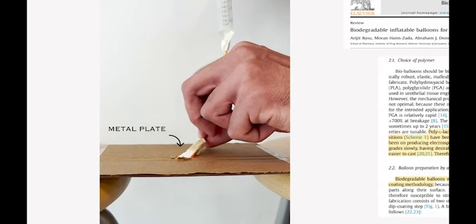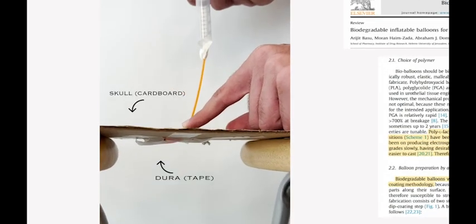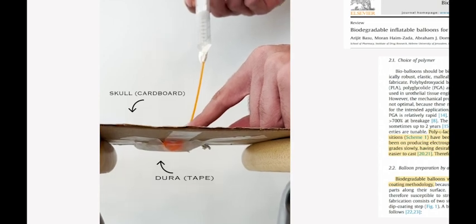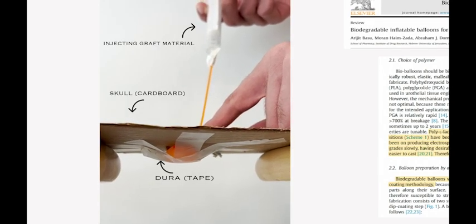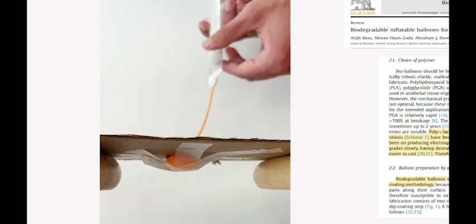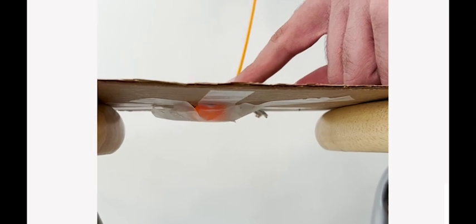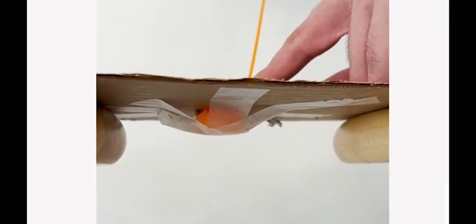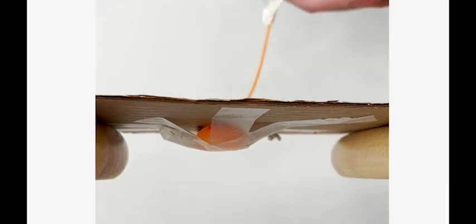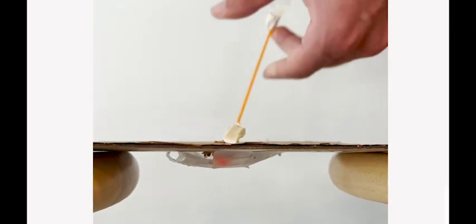The metal plate will initially separate the dura from the skull and guide the balloon into the correct position. Once in place, the surgeon can use the syringe to begin injecting the graft material. This then inflates the balloon, which elevates the dura away from the skull. Once the balloon is inflated to the desired size, the surgeon can detach the balloon and remove the rest of the device, leaving the balloon and graft in the correct place. Over time, the balloon will biodegrade, leaving behind the solidified graft material.